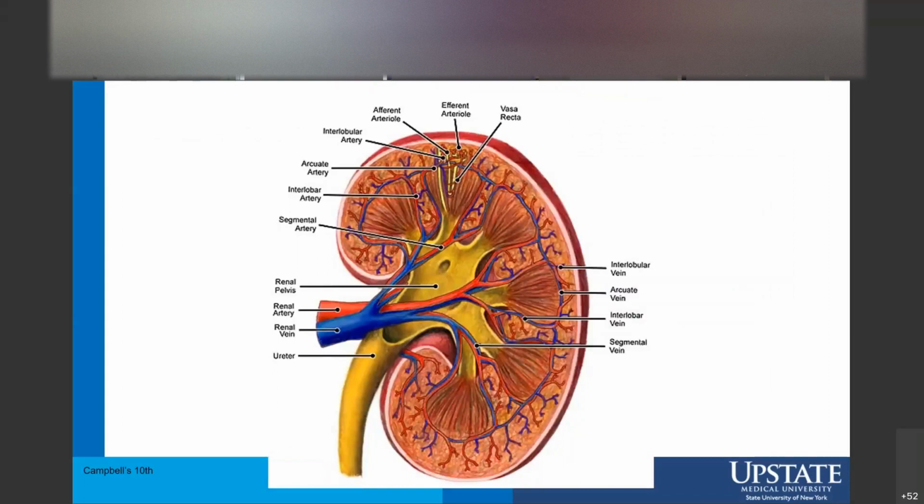Now, considering from the coronal view here, or more of a longitudinal view, we have these blood vessels that course through the kidney, and we'll talk a little bit more about why the kidney has its distinct shape. But if you go for the wrong calyx, like I'll show you a clinical example in a minute, what can happen is that you'll end up going into a lower pole calyx, and if you're not careful, you'll say to the interventional radiologist, can you please get me a lower pole access? And they'll oblige, they'll get you this calyx.